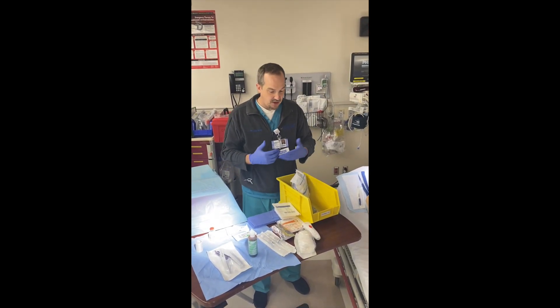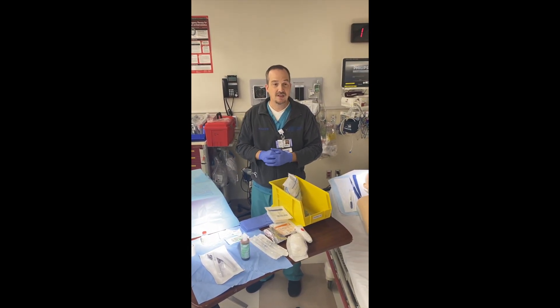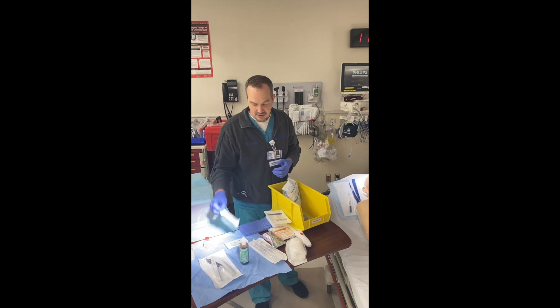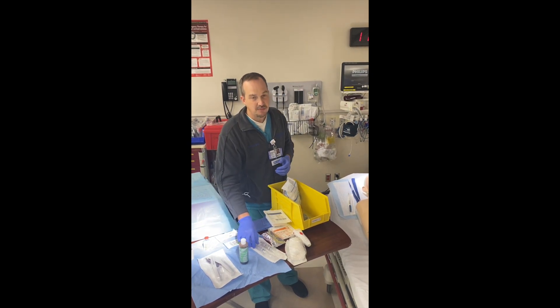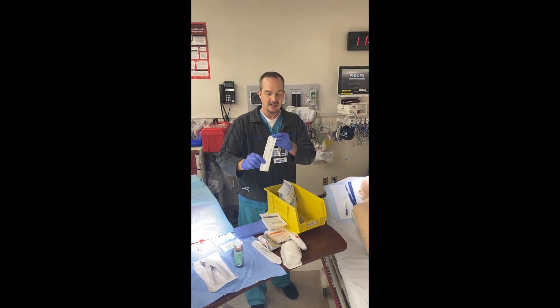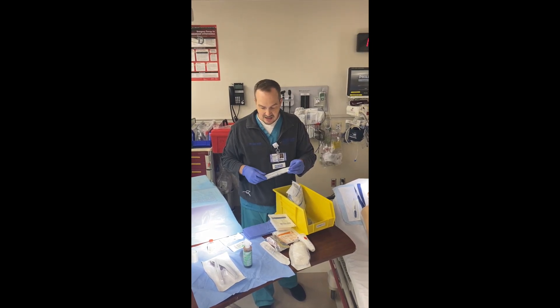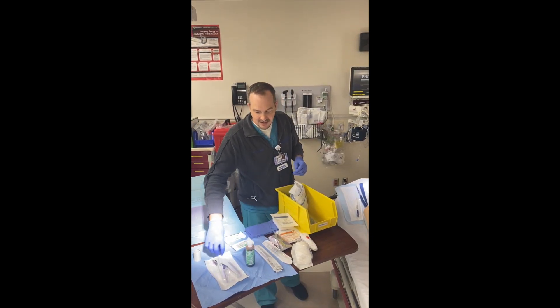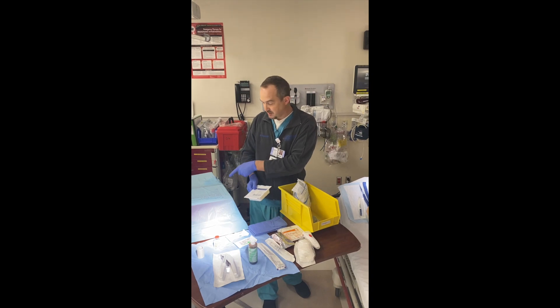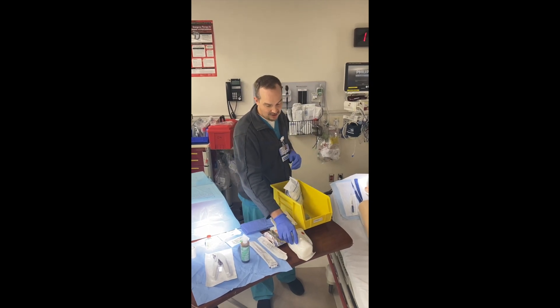From there, we're going to suit up, put on our gown and gloves, and be ready to go with the sterile part of the procedure. One thing we're going to need sometimes from the nursing staff is, after we get the local anesthetic, suture for securing the drain. Sometimes when we get the drain into the ventricle we get no flow, so we have to irrigate it. We will always need sterile syringes — that's most important — to irrigate the tubing so that the CSF can flow back into the drainage system. At the end, we're going to staple and secure the drain with the application of 4x4s, which are typically in the actual kit. Sometimes we'll wrap the head or put a tegaderm on top to secure everything a little bit further.